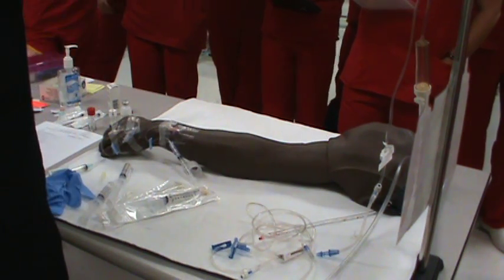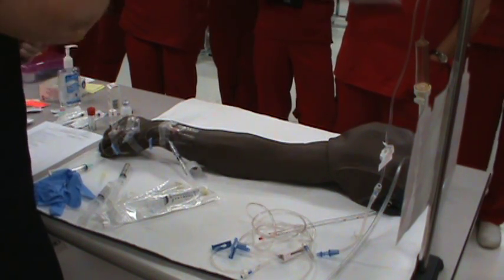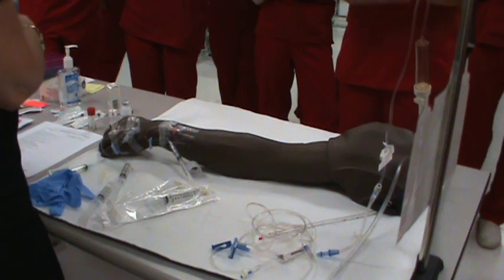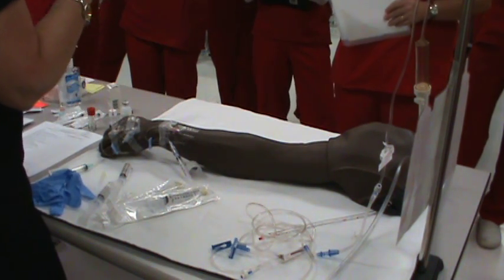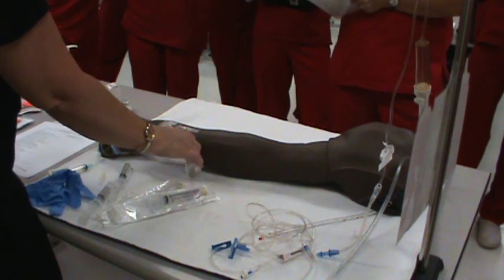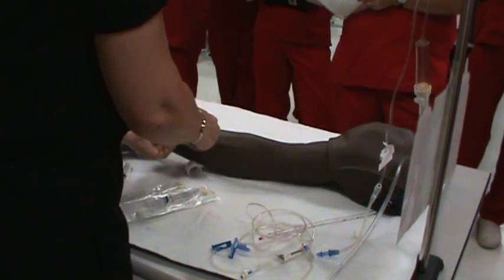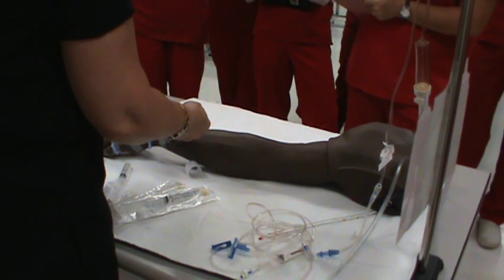But as Ms. Lopez said, if you're in with the adults, that's part of your assessment, and you've already checked it? Yeah. With a child, of course, you're checking it too. Most of the time, they have a KVO or fluids going. But yeah, you're going to check it. So then you give your medication. Yeah, that makes sense.